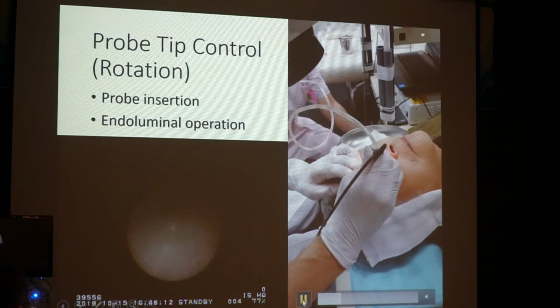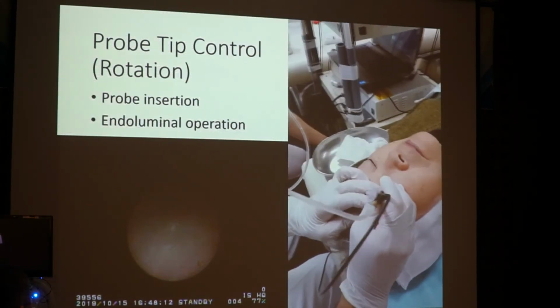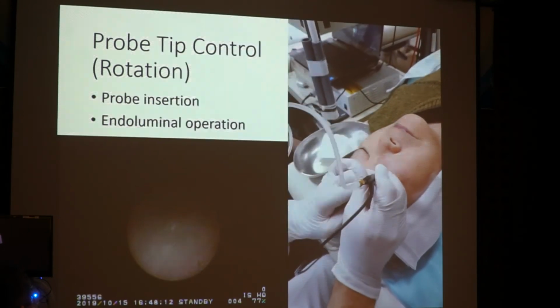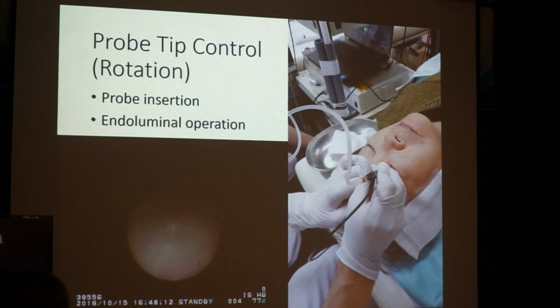Right after insertion, I correct the rotation like this. So in this video, I'm going to give you one tip, or one point, for beginners.